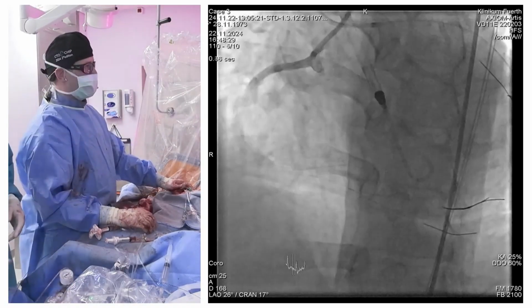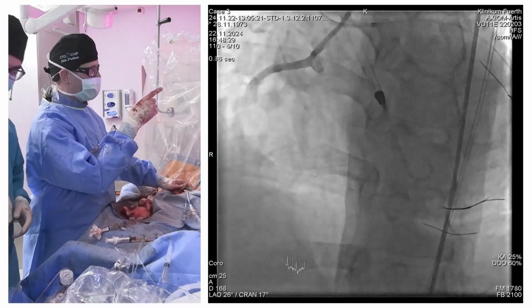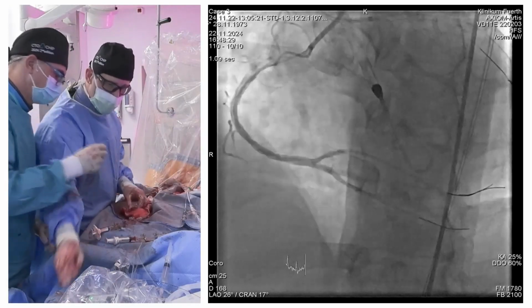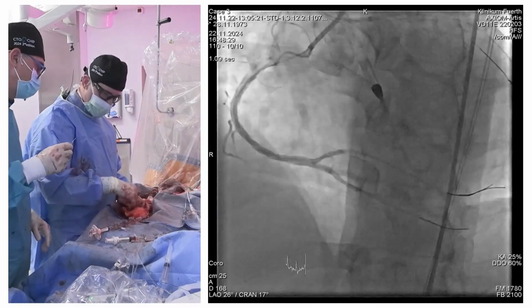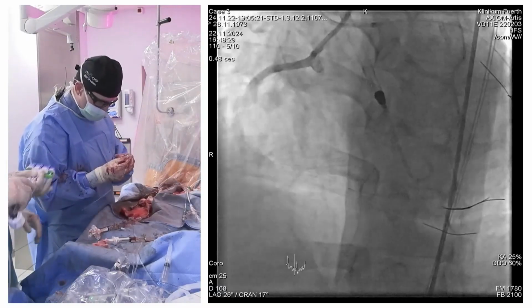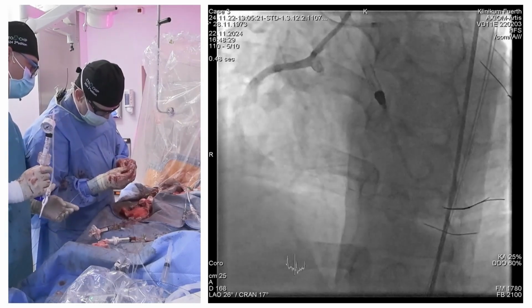I mean, here I just want to stent the entrance just because there's a dissection on the entrance of the stent. I think we get the good picture after a couple of times when all the side branches are preserved or the side branches are perfused again. So I think that's part of the deal, that we actually need a little time to get some restoration.